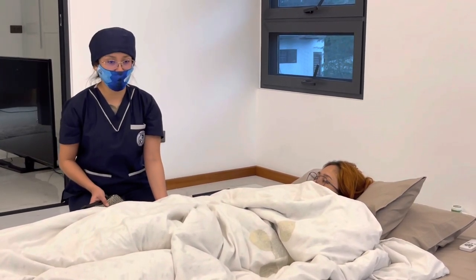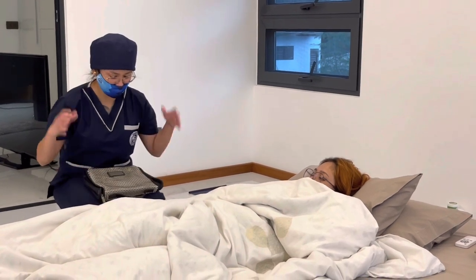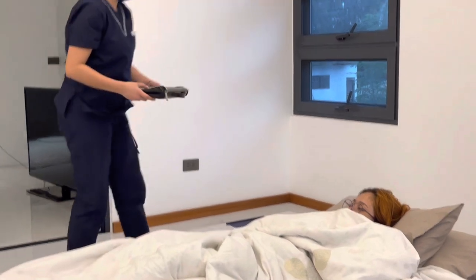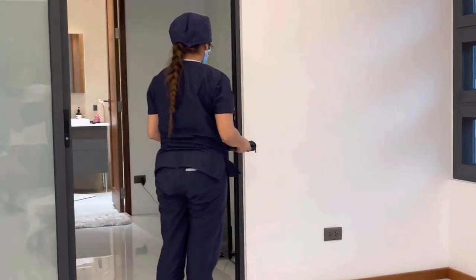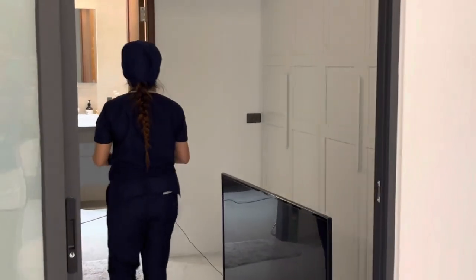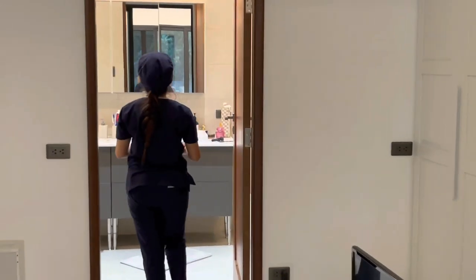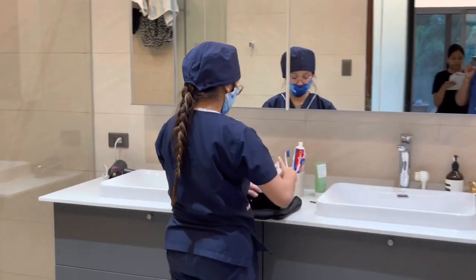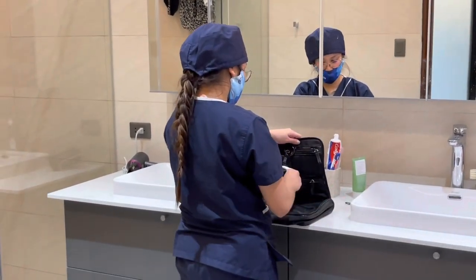Assuming I am done with the proper hand gloving. Carry the bedpan or urinal to the bathroom to transfer the specimen from the bedpan or urinal to the specimen bottle, filling 2/3 of the sterile container. Close the cap tightly. Use gloves to prevent contamination of the specimen and the caregiver.